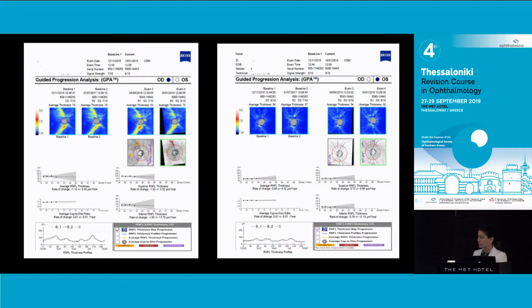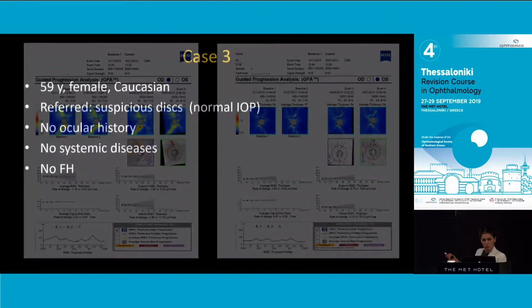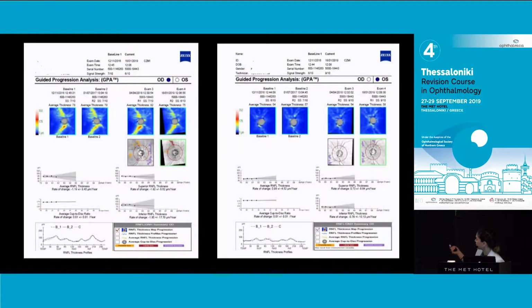This is an example of the Zeiss OCT, where you get your baseline to follow-up visits, change probability map, nothing highlighted here, and the graphs are horizontal. You don't have a lot of graphs, but we do have 4. Every point represents a test. So this is a lady doing well. And actually what happened was she fell asleep when she had the second eye done.